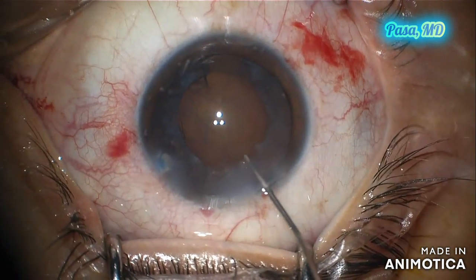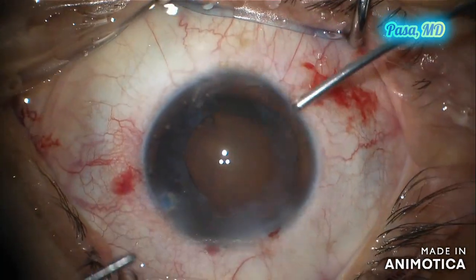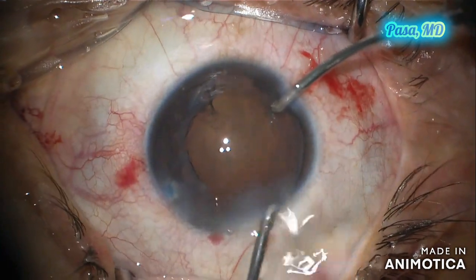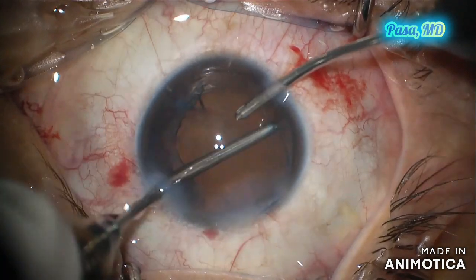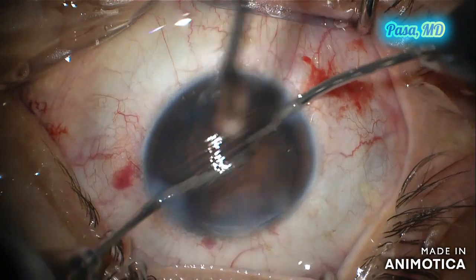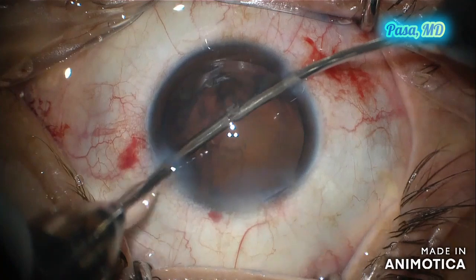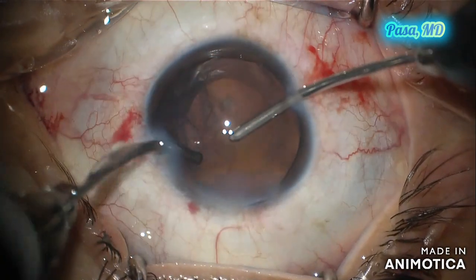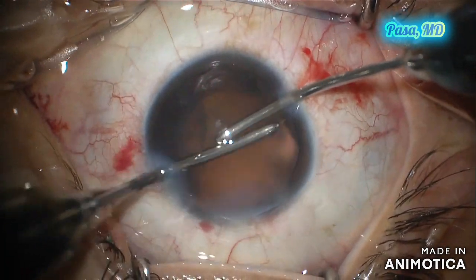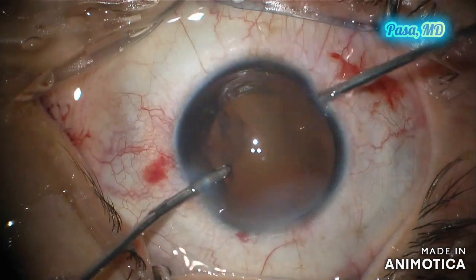I like this step — before cortex removal, if you have leftover viscoelastic, fill up the back to stabilize things and make sure the AC is inflated, so you don't get a big pressure gradient. Now peeling off the cortex from the posterior capsule and anterior capsule, reaching to the equator, then switching hands and removing it 360 degrees, with some gentle polishing.